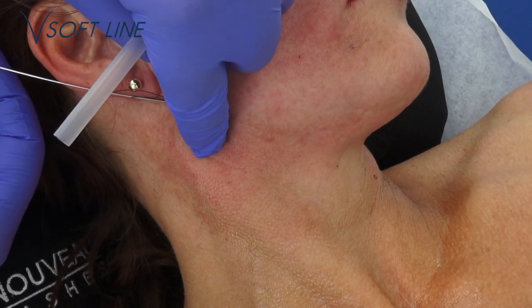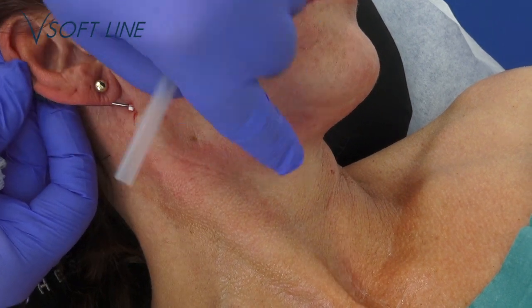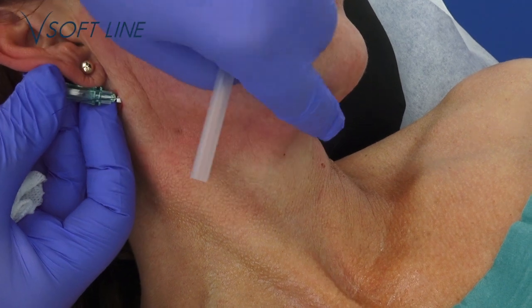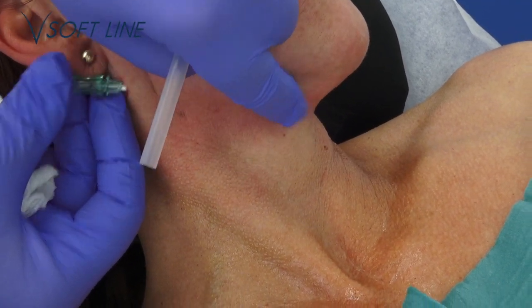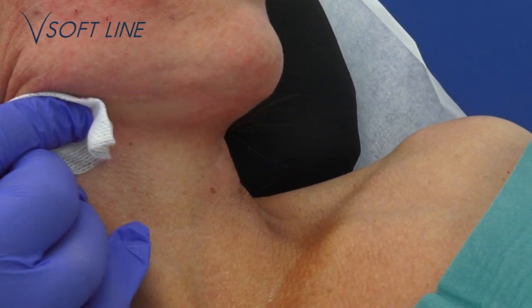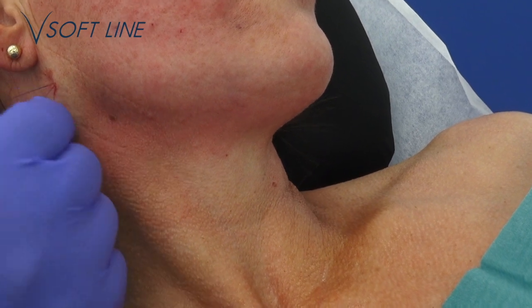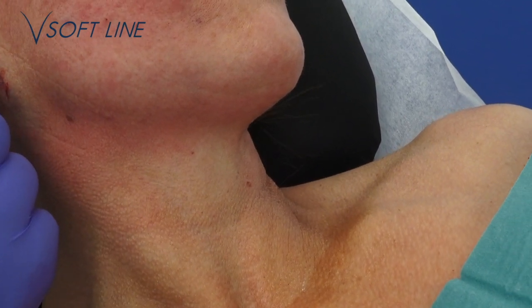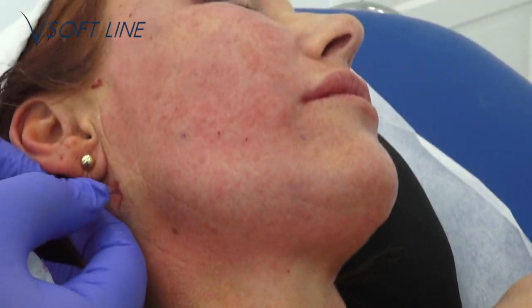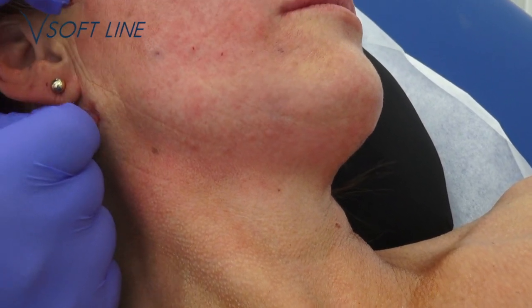Let's continue with the lower jawline. Here you can see the point of the needle. There. And pulling the threads all at once together, we get the lifting effect. And so the contour of the jaw, the jawline, appears more defined.